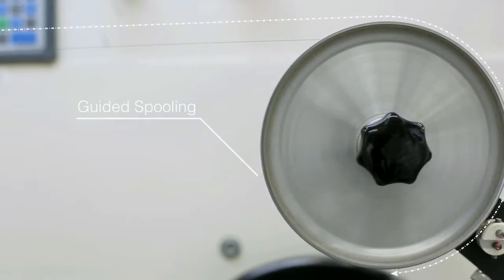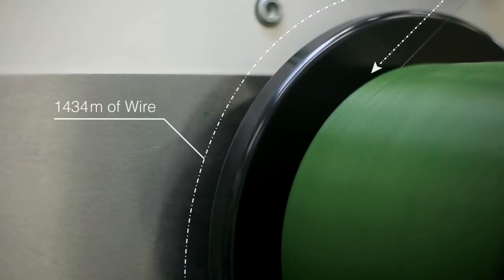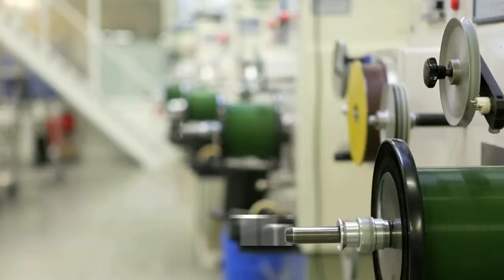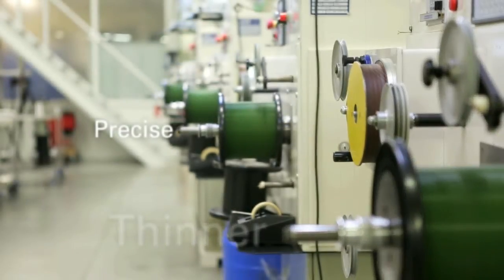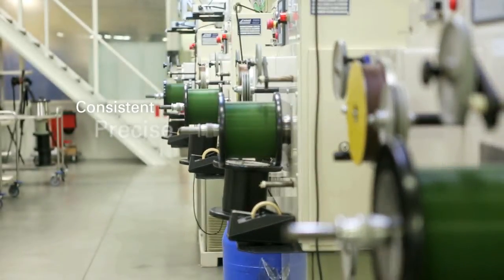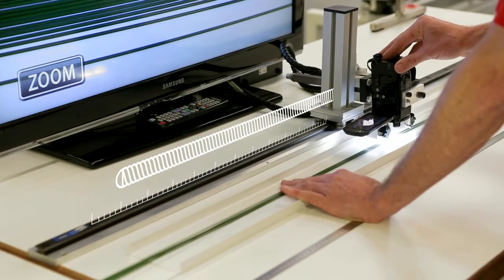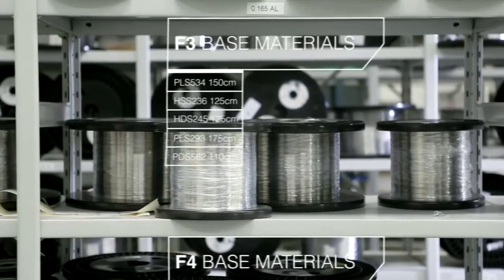The Merit Medical difference starts with proprietary spool-to-spool continuous coating technology, working together with advanced materials to apply coatings that are thinner, more precise, and more consistent than any spray or dip coating method, and a curing process that has limited impact on the mechanical properties of most base materials.